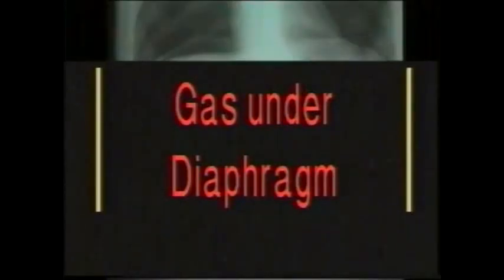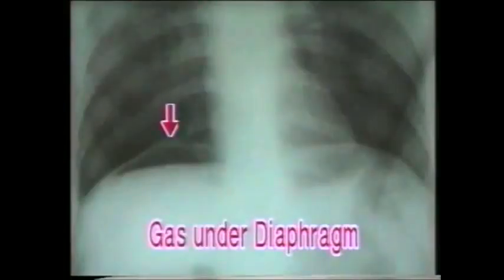Gas under diaphragm: In a standing x-ray of the abdomen, free gas in the peritoneal cavity rises to the highest level and comes to lie under the diaphragms, more commonly under the right dome of diaphragm above the liver. Note the crescent-shaped black radiolucent shadow of gas under the right diaphragm, shown by the red arrow.